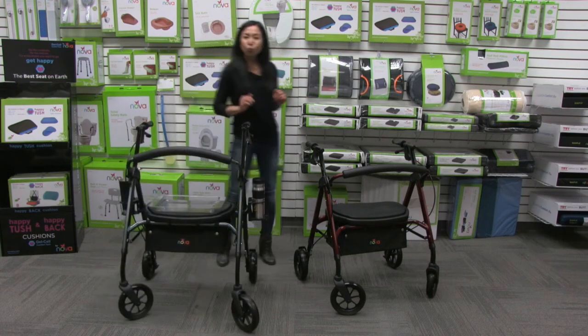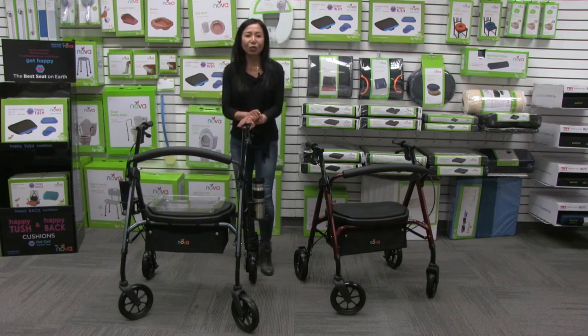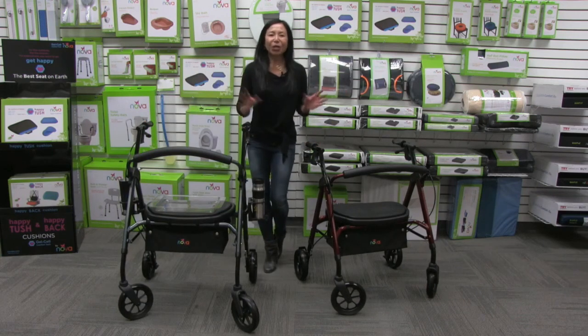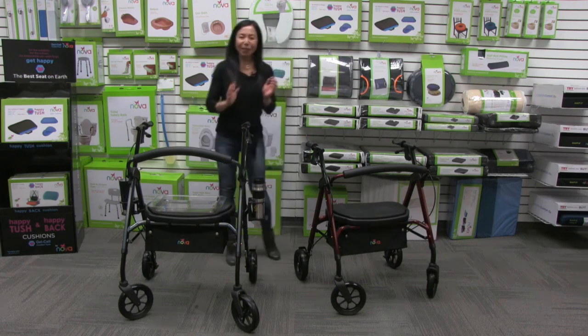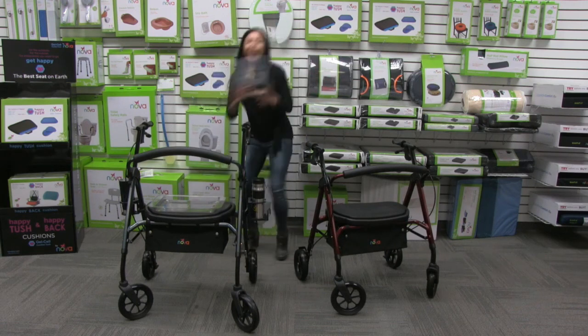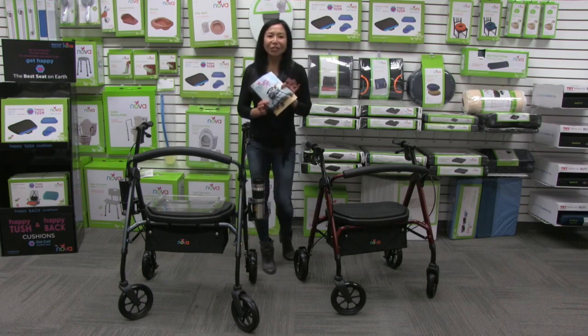Those are the great accessories that go with the Star 8 DX — our newest rollator that I'm so excited about. As with all Nova products, it comes with care, use, and warranty information and details on how to contact us any time.